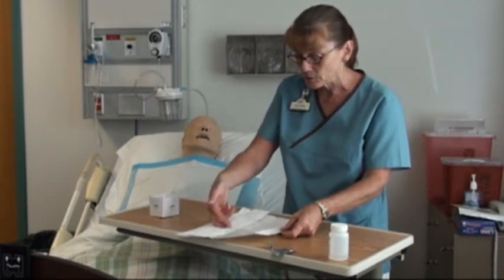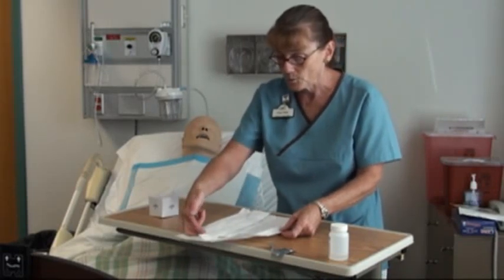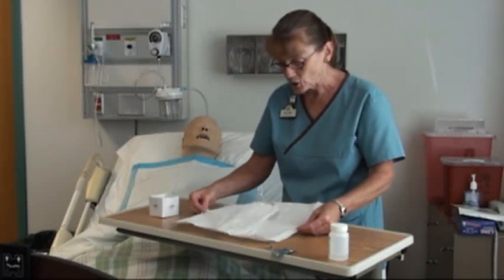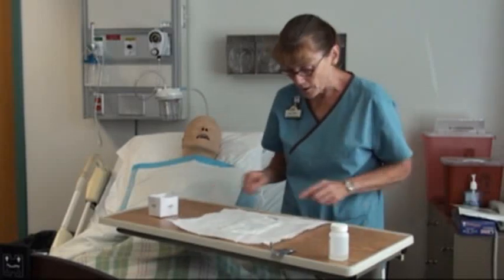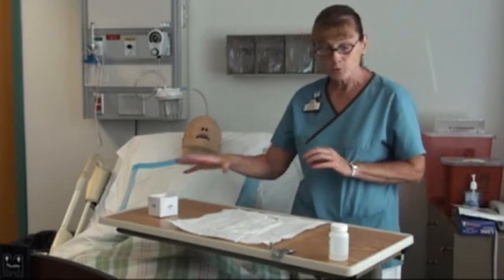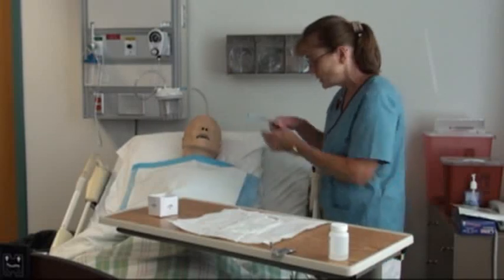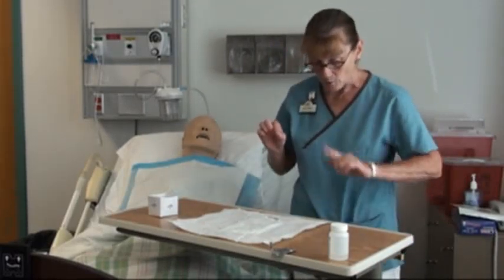Go ahead and open up — there's a little sleeve here that you put your fingers under to open up, and that's your one-inch margin. Crease your paper back to the side so it'll stay open. One inch is contaminated where I can touch; the rest is not. She's still doing fine — I do what I call a reality check. I've got my saline ready to go, my suction on, and my surgical tube here, so it looks like we're ready to go.